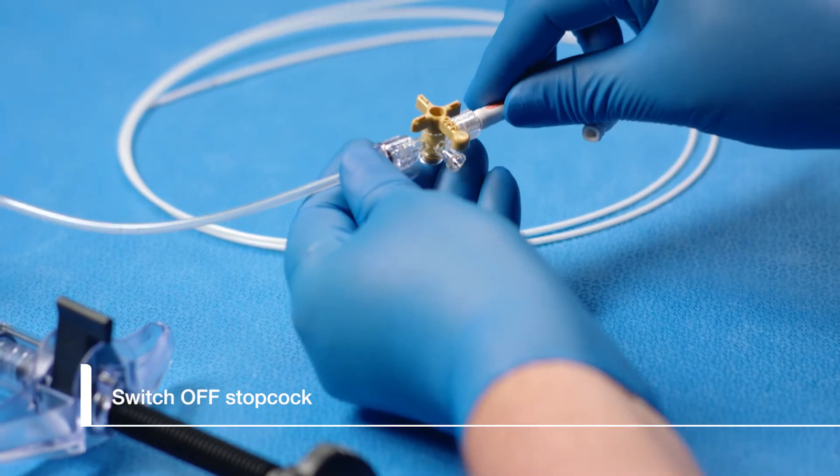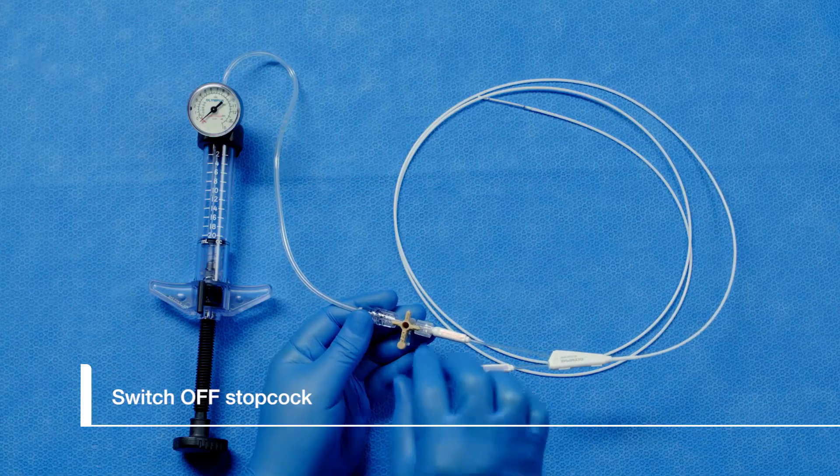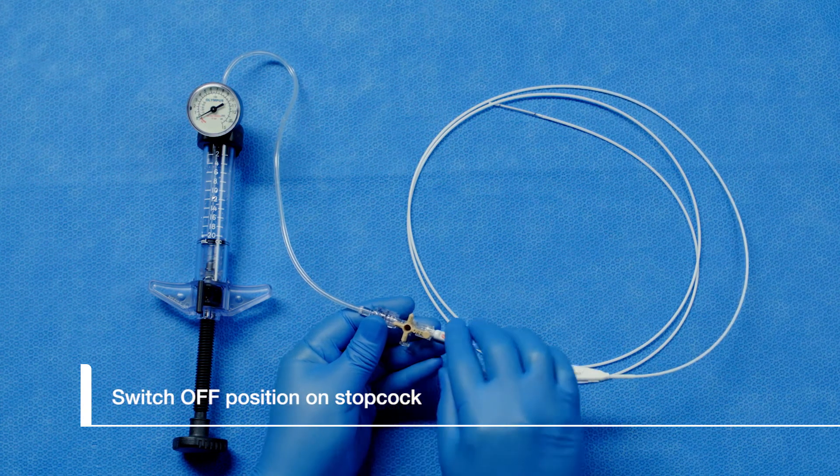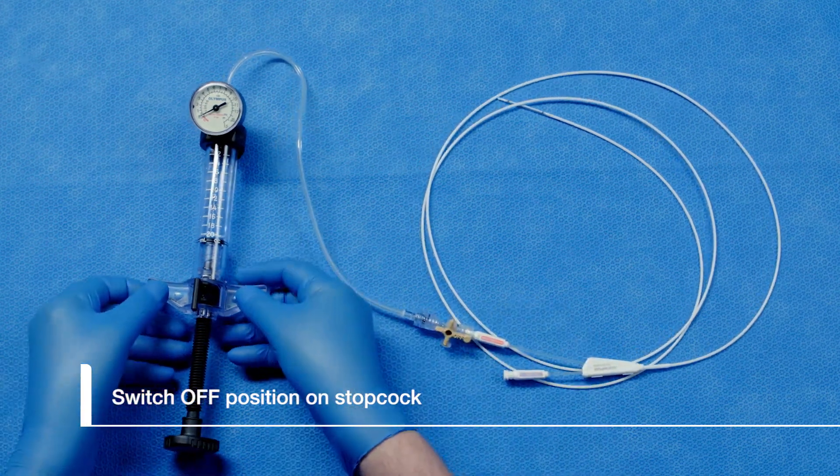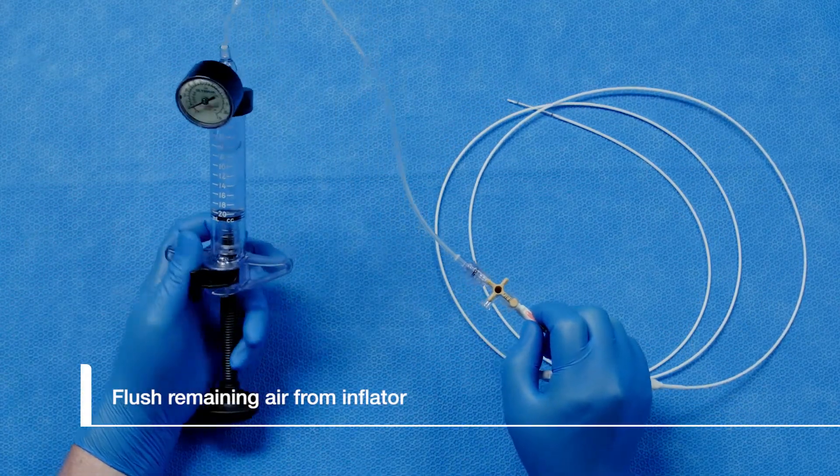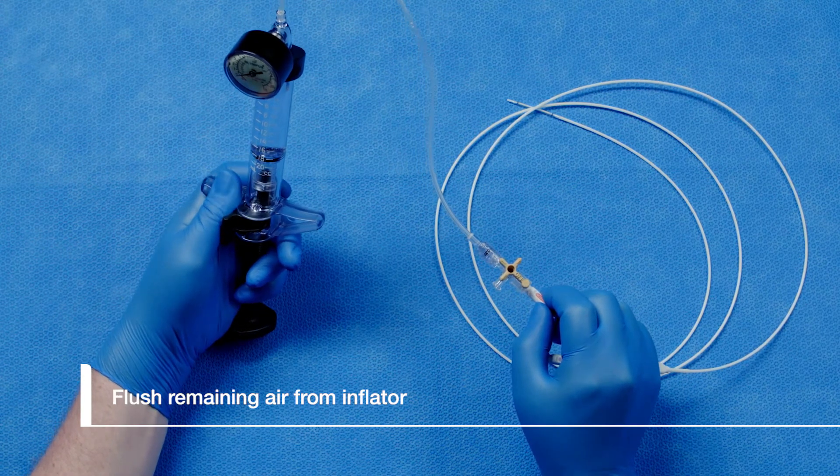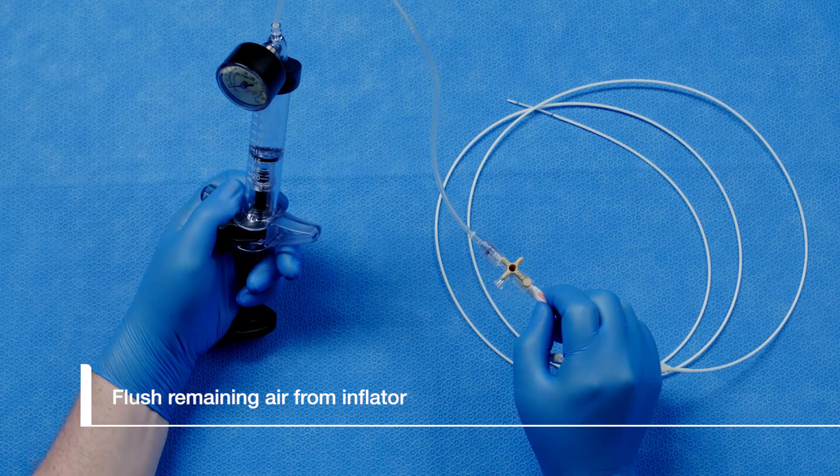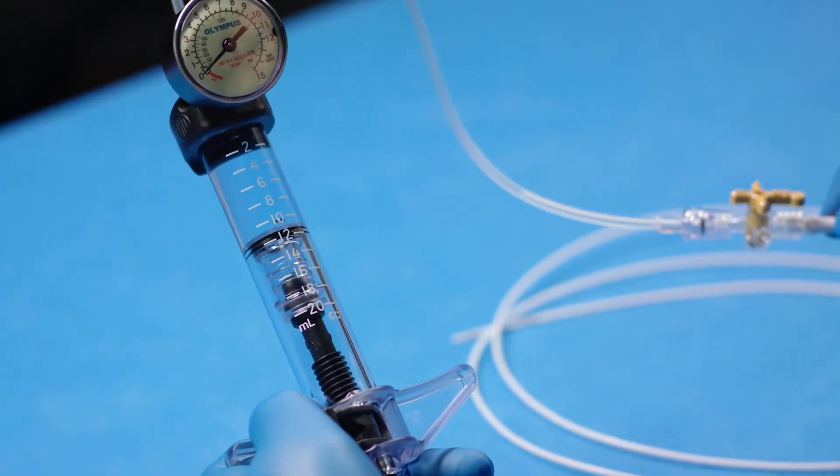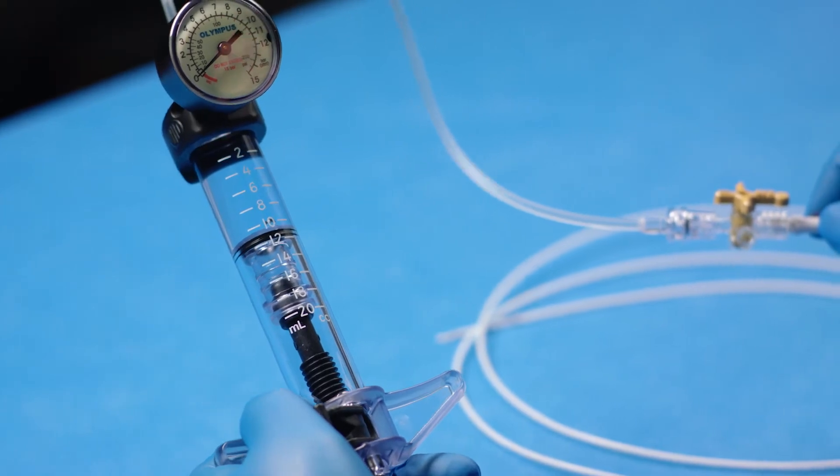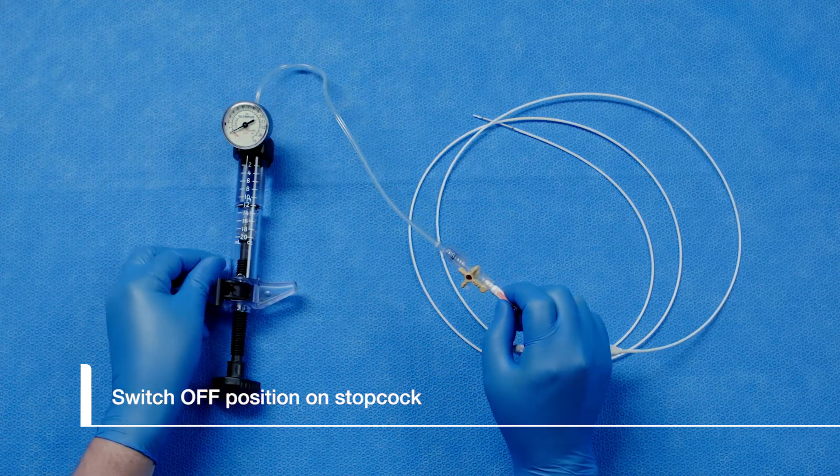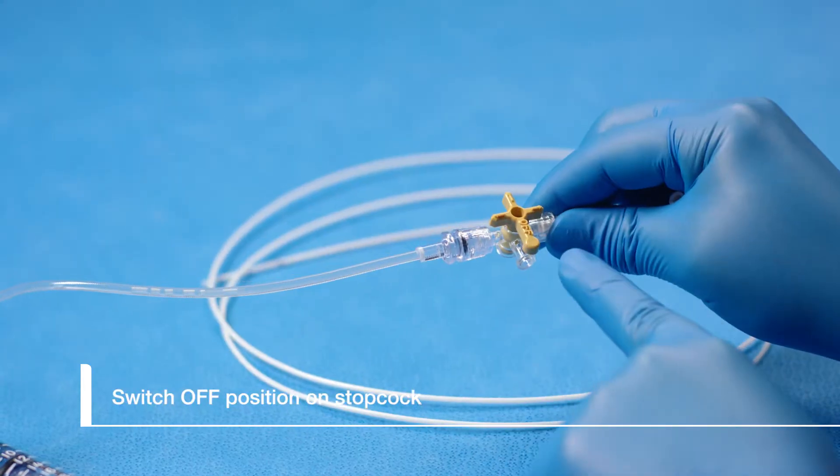Before releasing air from the inflator, we need to turn the switch on the T-piece off to the balloon. When the stopcock is switched off to the balloon, you will hear the vacuum in the inflator release. Now we will turn the locking switch on the inflator back to the left. We will bleed off the remaining air in the inflator through the side port on the stopcock. Slowly advance the plunger until fluid begins to come out of the side port on the stopcock. Once all of the air is removed, switch the side port of the stopcock to the off position as shown.